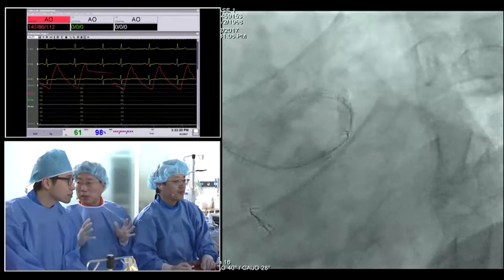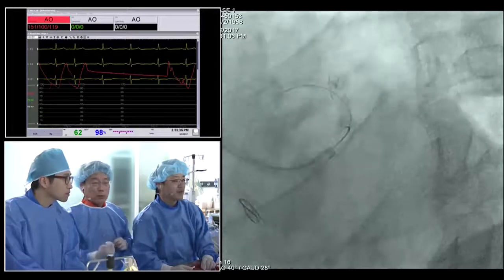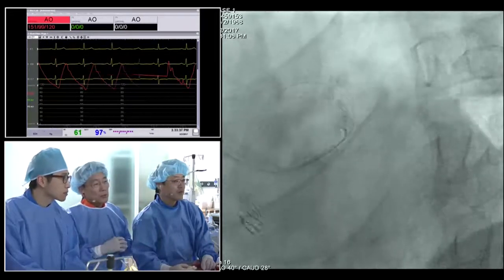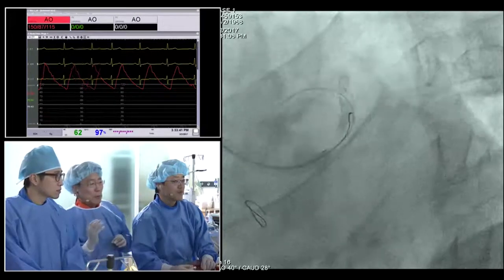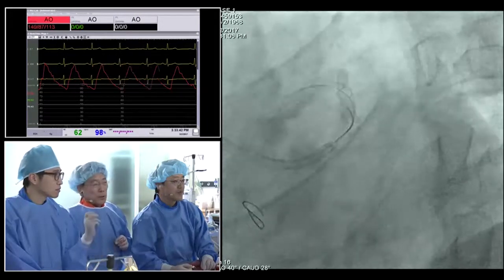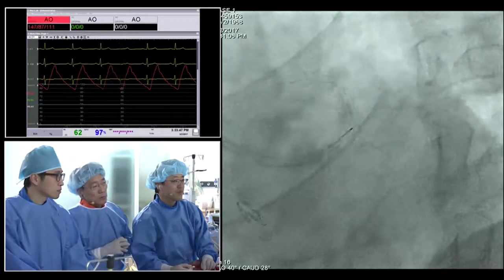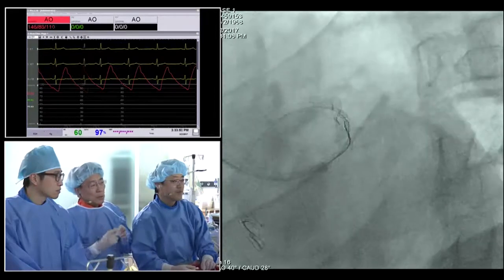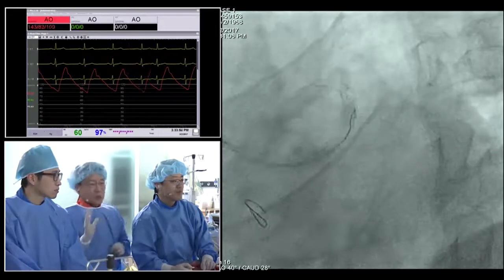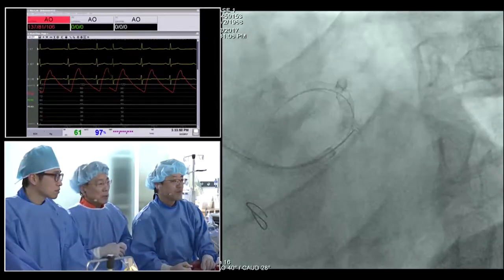Big effective stent areas, relatively lower frequency of stent thrombosis rate, et cetera. To be honest, I don't believe different types of drug-eluting stent can make a different clinical outcome. There are some advantages and disadvantages in terms of side branch size, something. However, still, it doesn't matter. It's not a big deal.